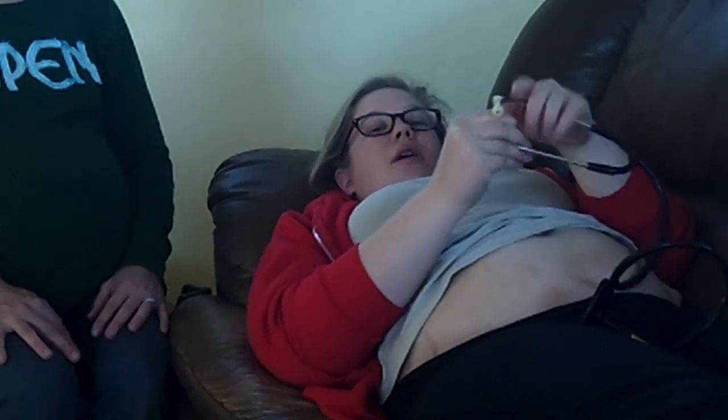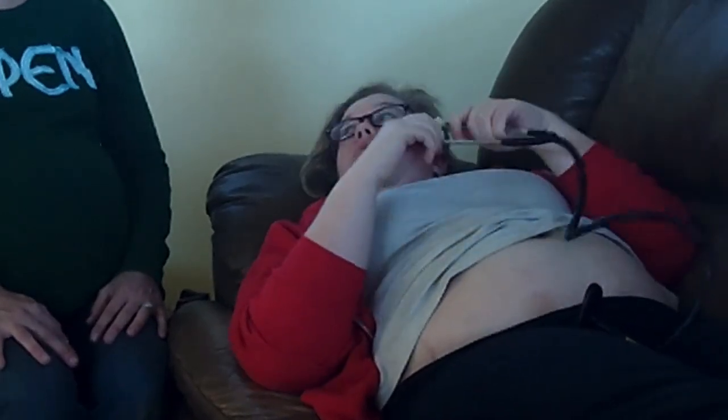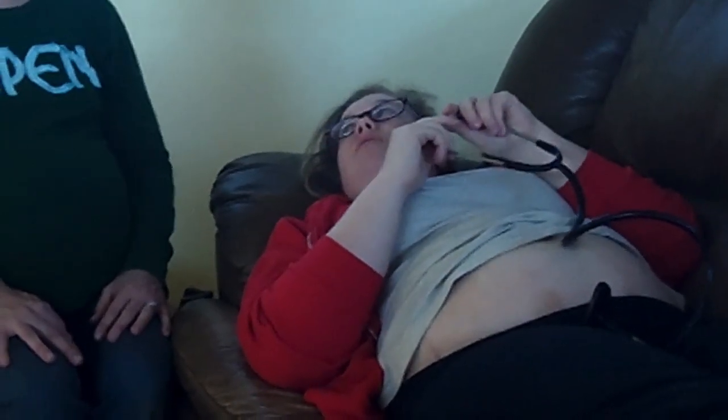So I'll show you what that looks like. If you want to talk about other sounds we might hear, especially early on, while I do that. Sure. Like Margot said, the uterus at this point isn't that big. You kind of have a contained area, which should make it easier in theory, although the baby is small at this point, so it's not always as easy as it sounds.